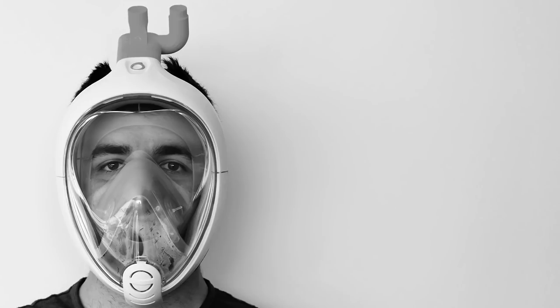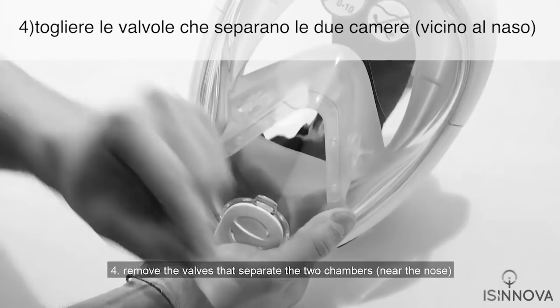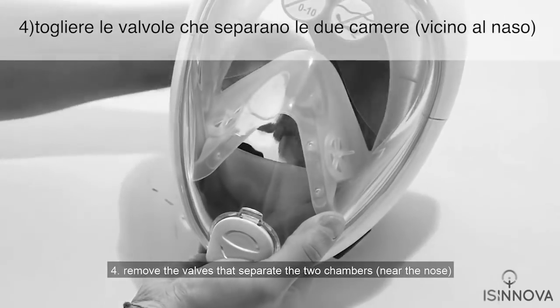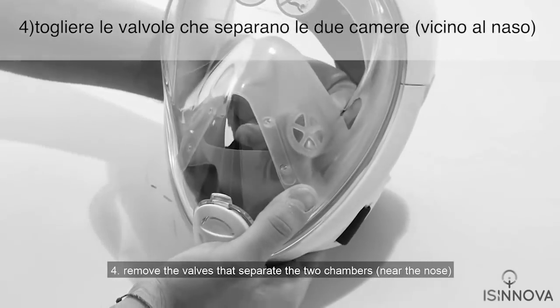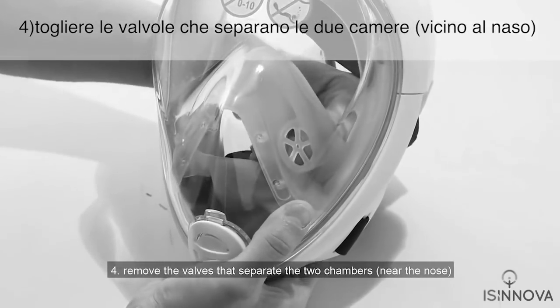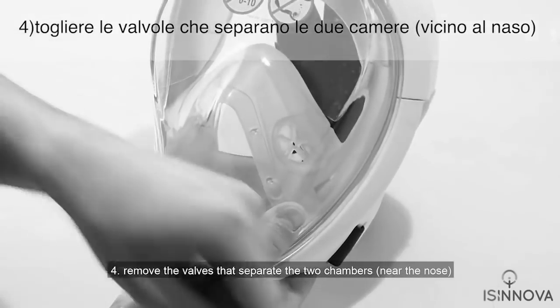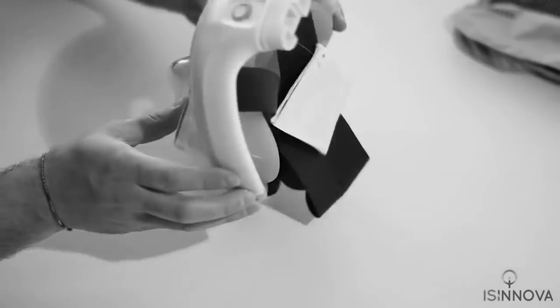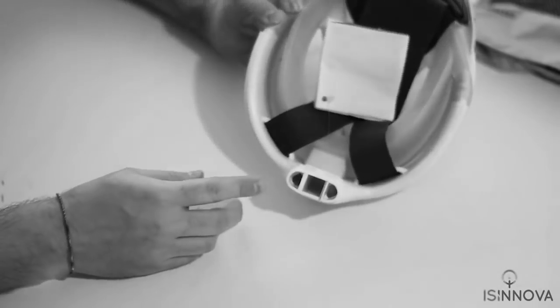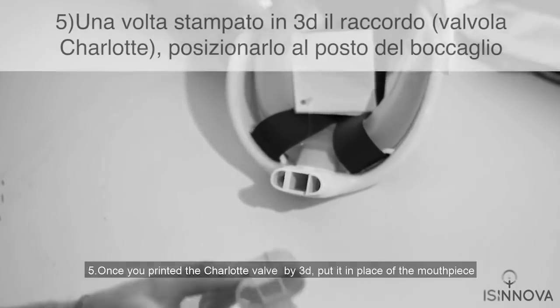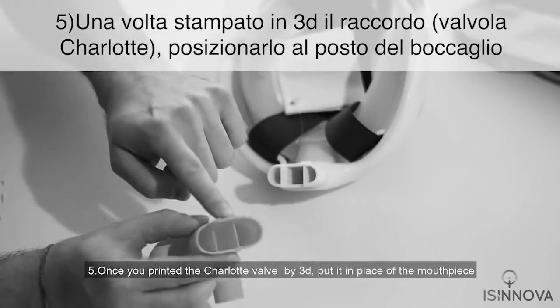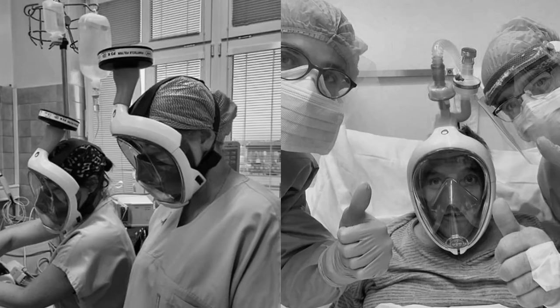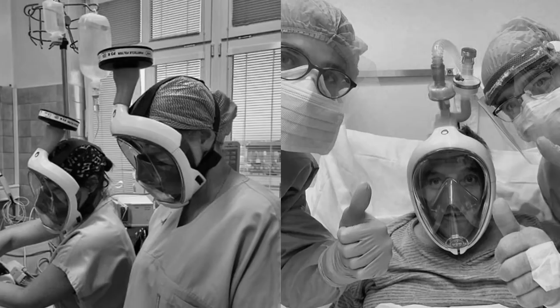Designers at Isinnova working with doctors in Italy have repurposed the Decathlon snorkeling mask by adding a custom 3D printed valve to the top. This modification turns into a perfect emergency ventilator mask, which doctors in the country have been desperately in need of. The files are available on their site, and I'm sure this technique could be adapted to different snorkeling mask manufacturers around the world.